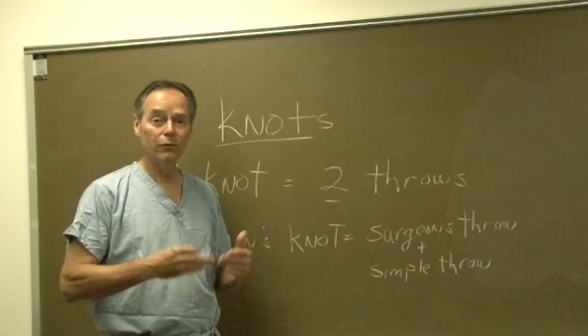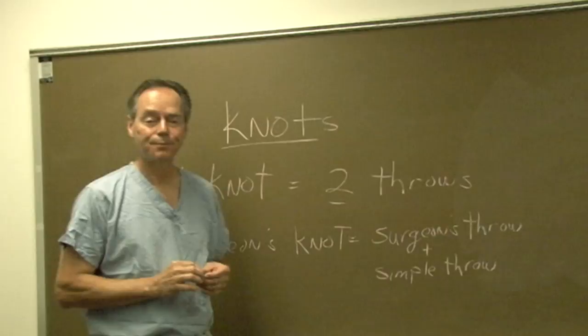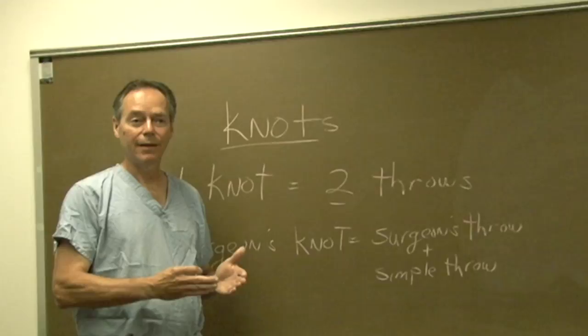Now you may use additional throws. For instance, if I said create a surgeon's knot followed by two additional throws, it's basically a surgeon's knot and then on top of that is a square knot comprised of two additional throws.